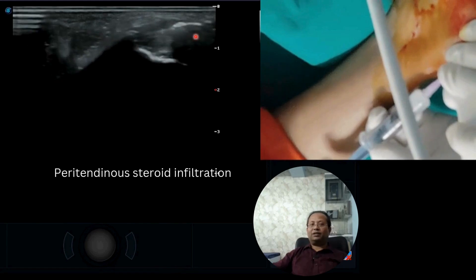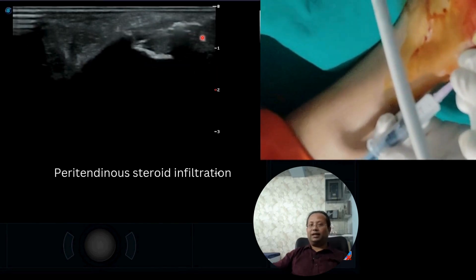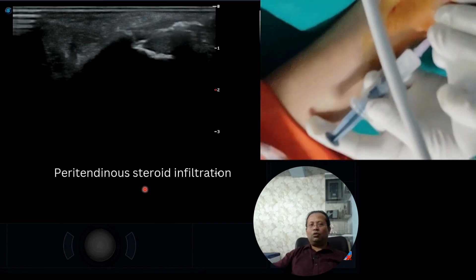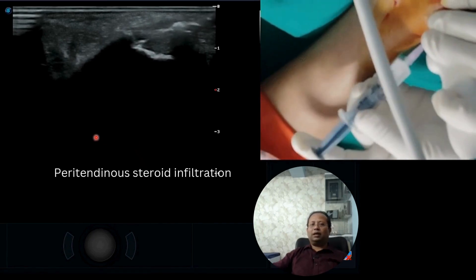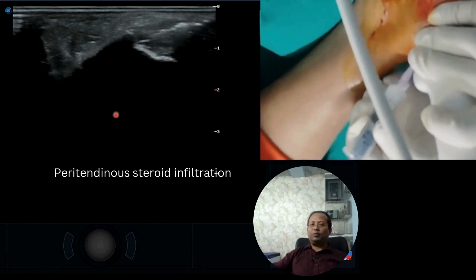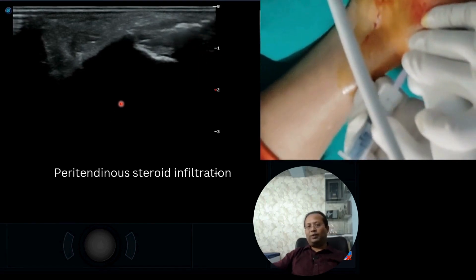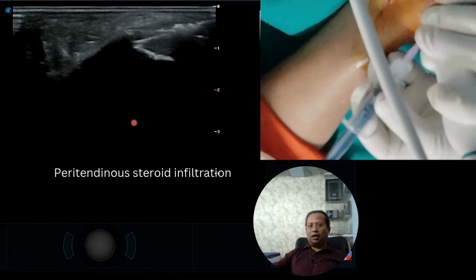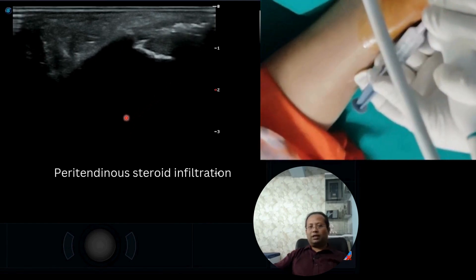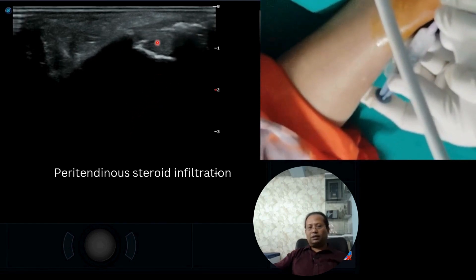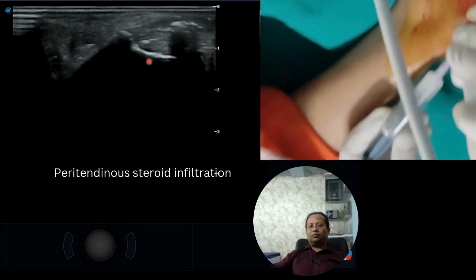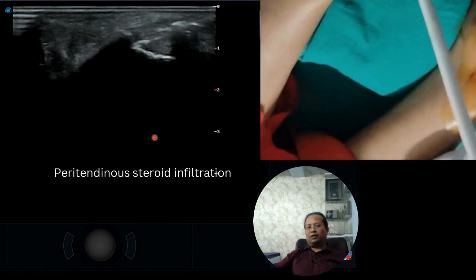The peritendinous infiltration of steroid is being done here. We did not choose PRP because this was an acute presentation and the patient was in acute pain, so for early relief we chose steroid as treatment. The steroid has been given peritendinously and after the tenotomy was completed.